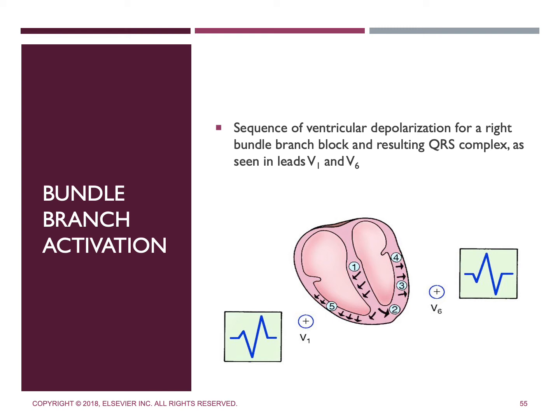small R wave. So as the left bundle continues to conduct impulses, the entire left ventricle is depolarized from right to left. So what this does is it produces movement away from V1 and results in a negative deflection. So an example would be an S wave. So now the impulses that depolarize the left ventricle conduct through the myocardial cells and depolarize that right ventricle.